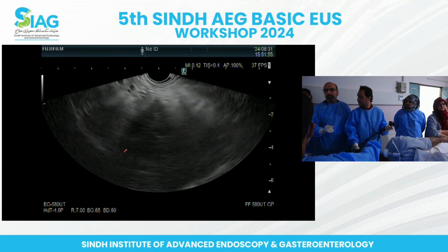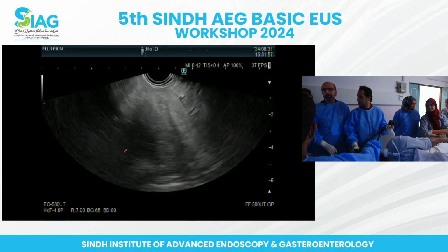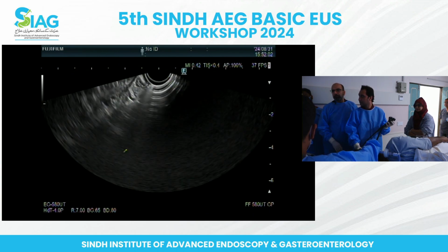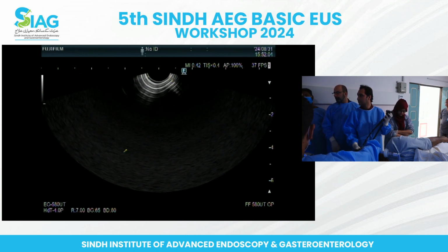I want you to see the bulb station too. So yeah, look endoscopically. Good. Keep advancing.